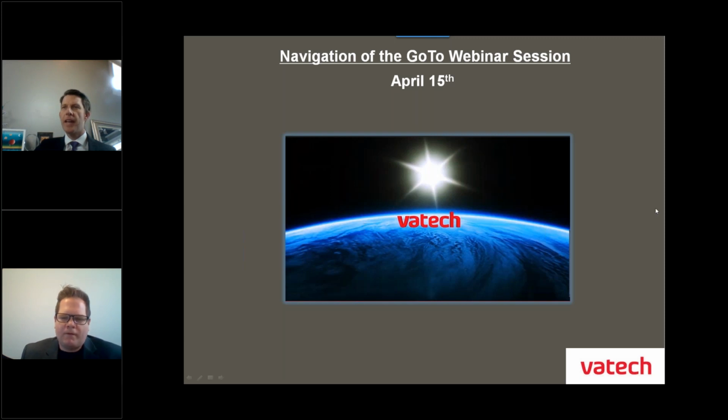Paul, I think that's all the things we need to cover before we start the session. Shall we go ahead and get into the software and look at some of our cases? Absolutely. Let's do it. Sounds good.